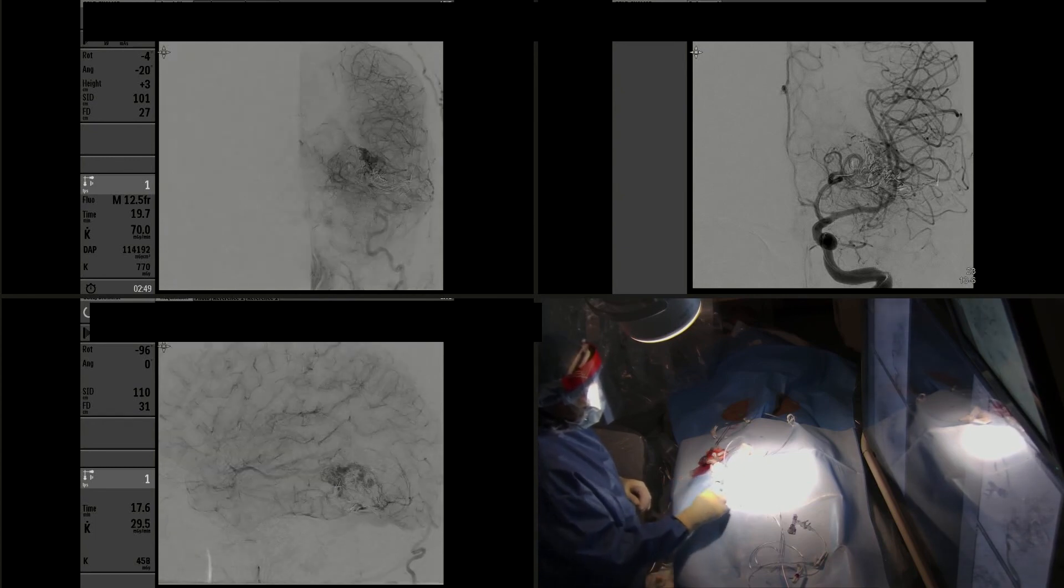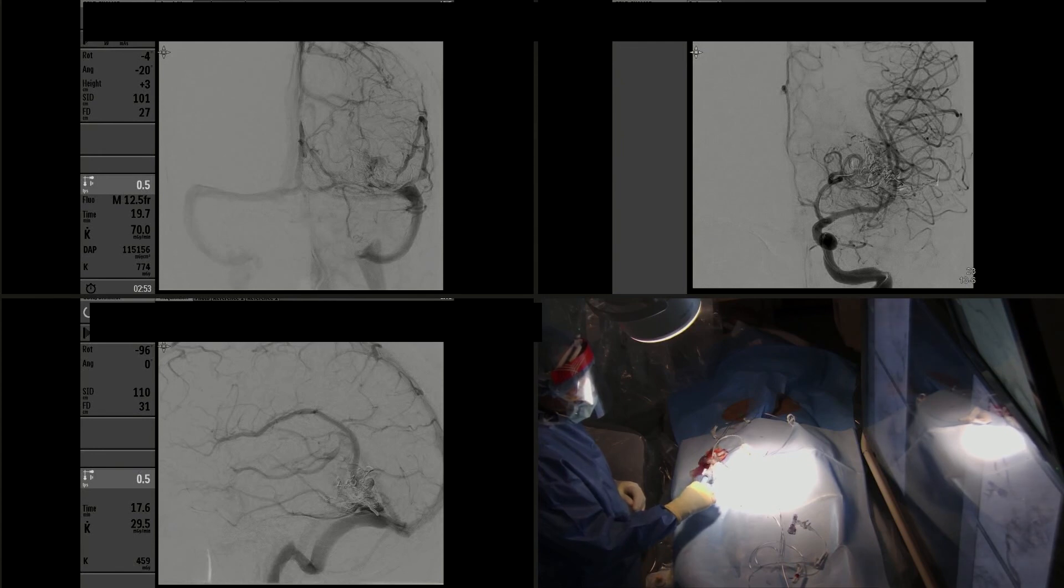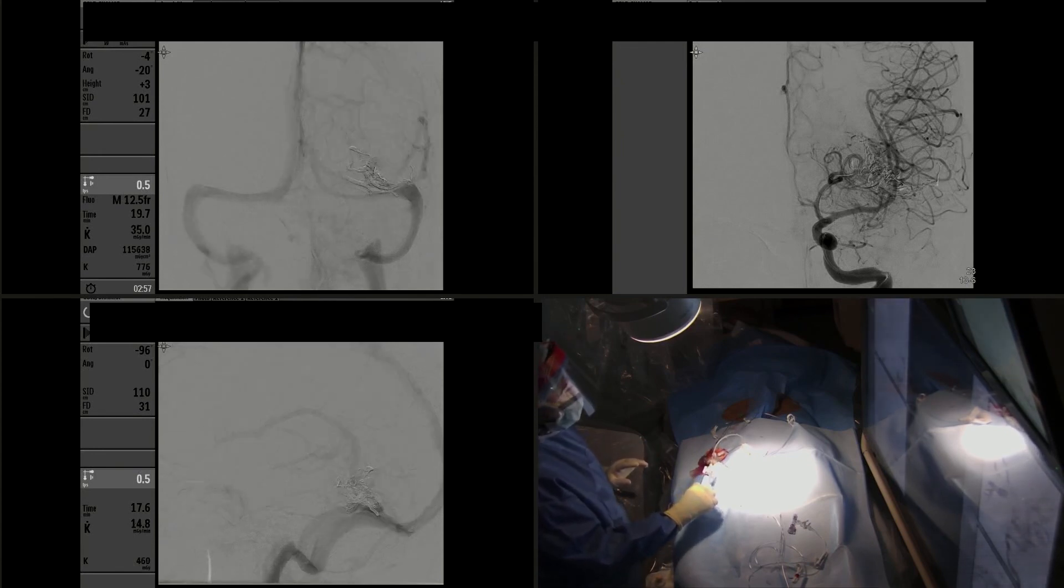The angiogram shows that there has been significant devascularization with residual arterial shunting and without venous outflow restriction. The patient went to the operating room, and the post-operative angiogram after resection demonstrates complete obliteration of the AVM without thromboembolic complications.